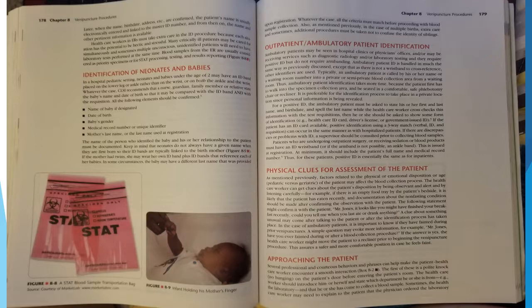Thus, ambulatory patient identification takes more time because the patient first has to walk into the specimen collection area and be seated in a comfortable, safe phlebotomy chair or recliner. It is preferable for the identification process to take place in a private location since personal identification is being revealed. For a positive ID, the ambulatory patient must be asked to state his or her first and last name and birth date and spell the last name while the healthcare worker cross-checks this information with the test requisitions.